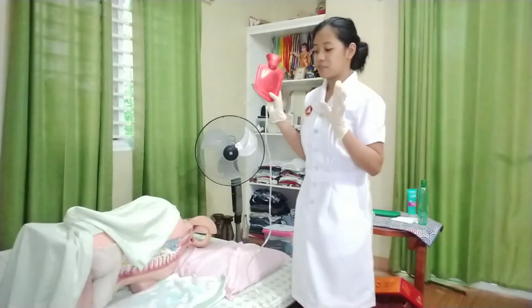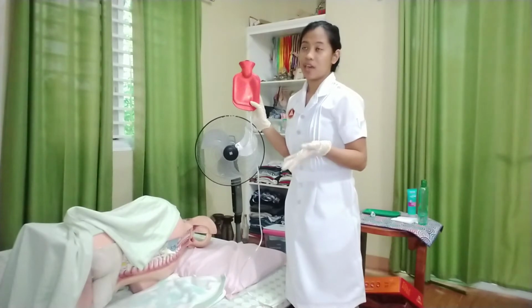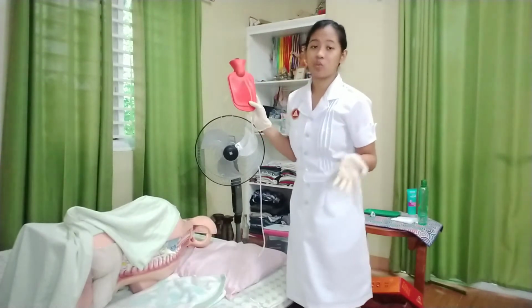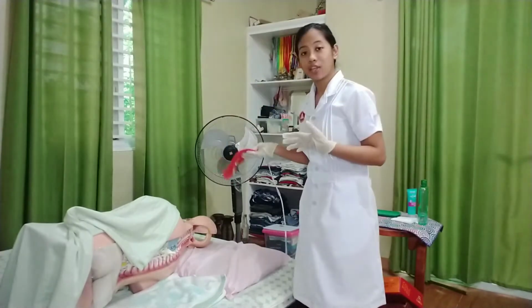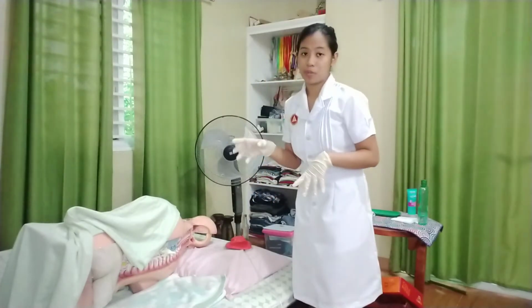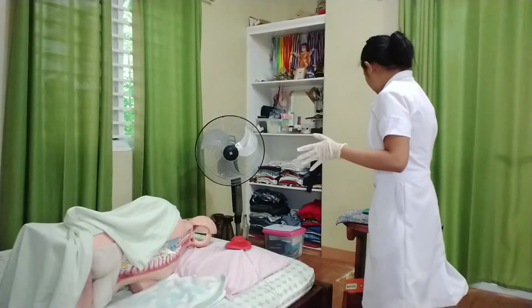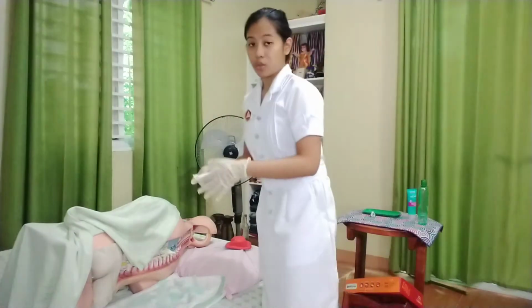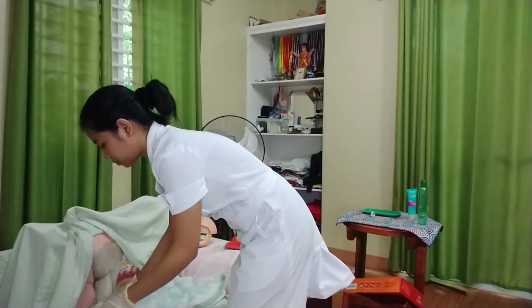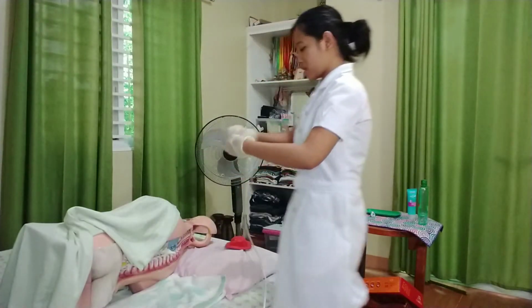So after all of the fluid is instilled, or the client says that he or she cannot hold it anymore and wants to defecate, then lower the container and close the clamp, and then withdraw the rectal tubing from the anus. We will use a paper towel when withdrawing it. So we will withdraw it, and we will wrap it and dispose.